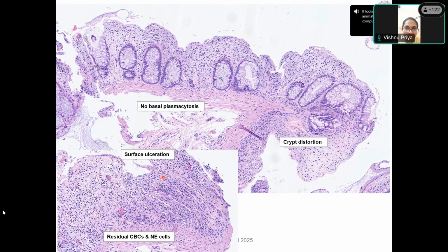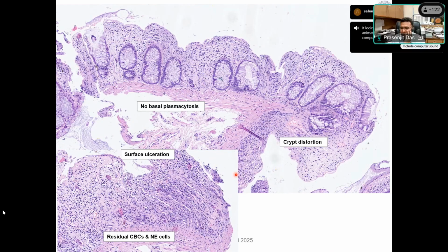So if in a post-transplant patient, we see a mucosa which is ulcerated and a large patch is not showing you crypt, what you will think of? At least suspect and ask the clinician. Graft versus host disease, yes, exactly. You have to go into high power. You have to look for lymphoepithelial lesion. You have to see if the crypt apoptotic activity is high, apoptotic abscesses are there. Eosinophilia may be seen sometimes, but basal plasmacytosis usually is not there. So this is actually an example of GVHD.